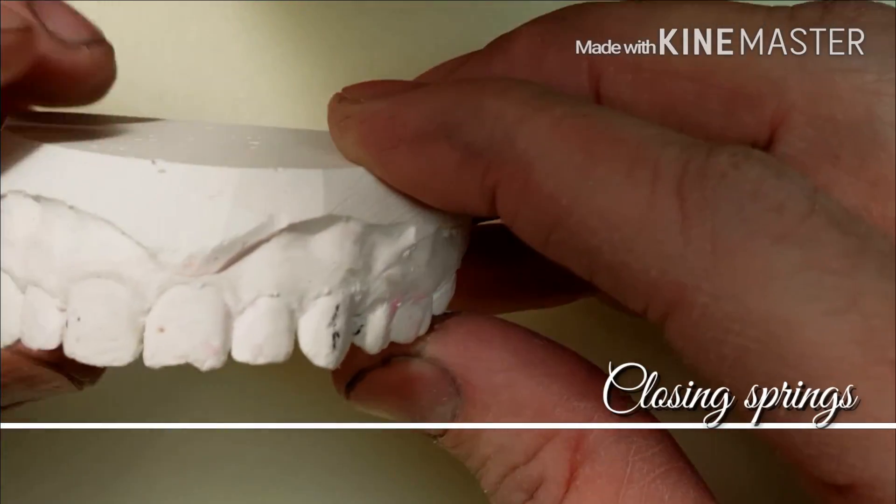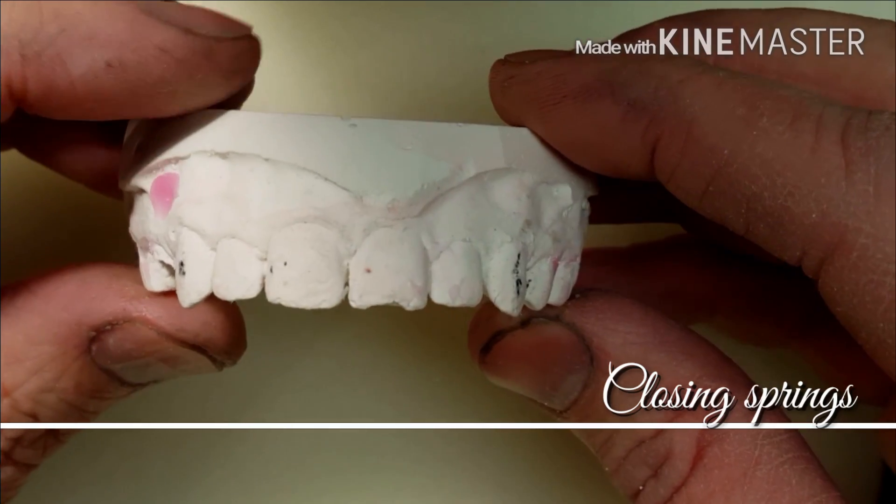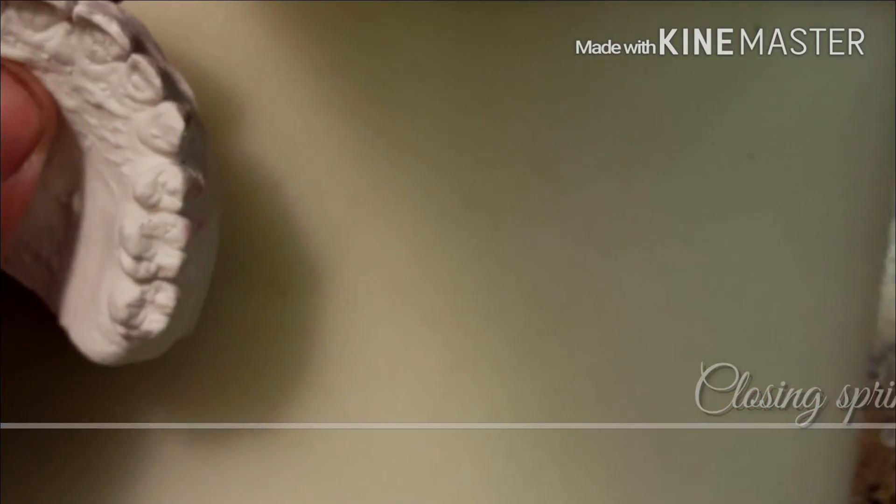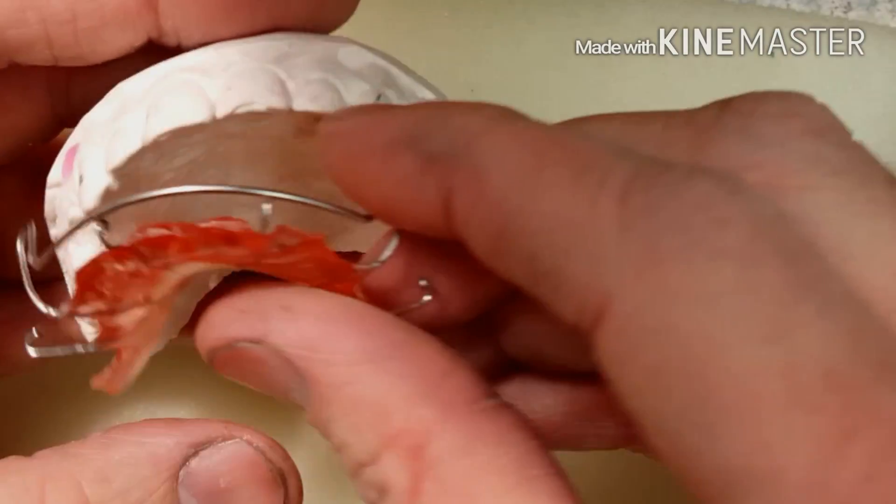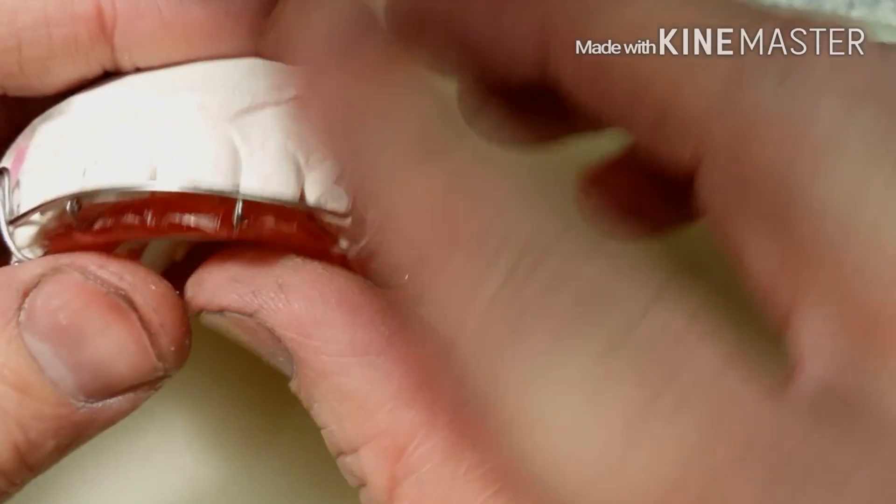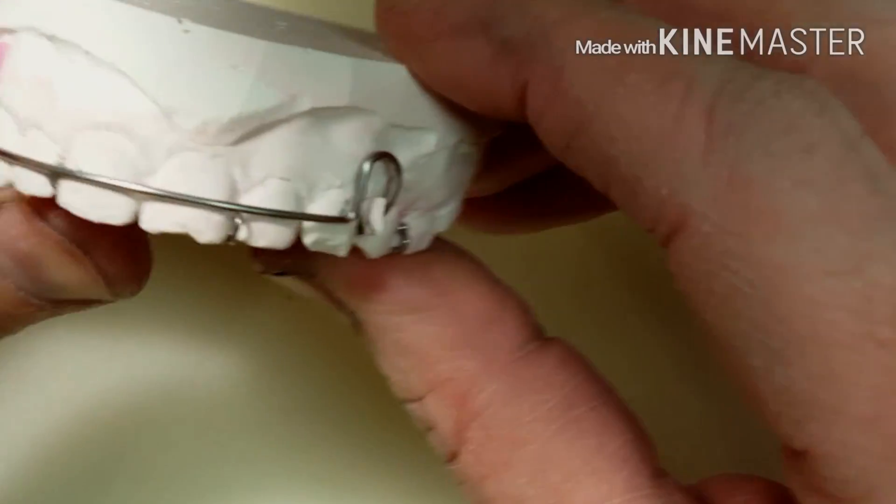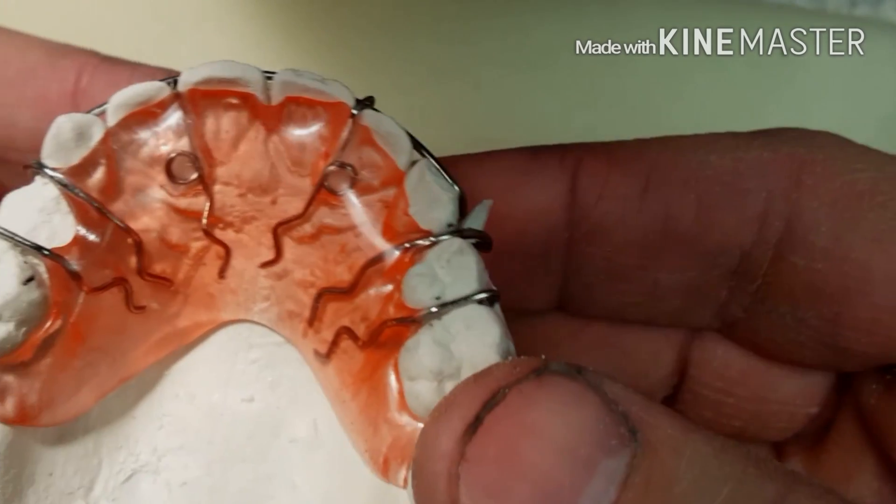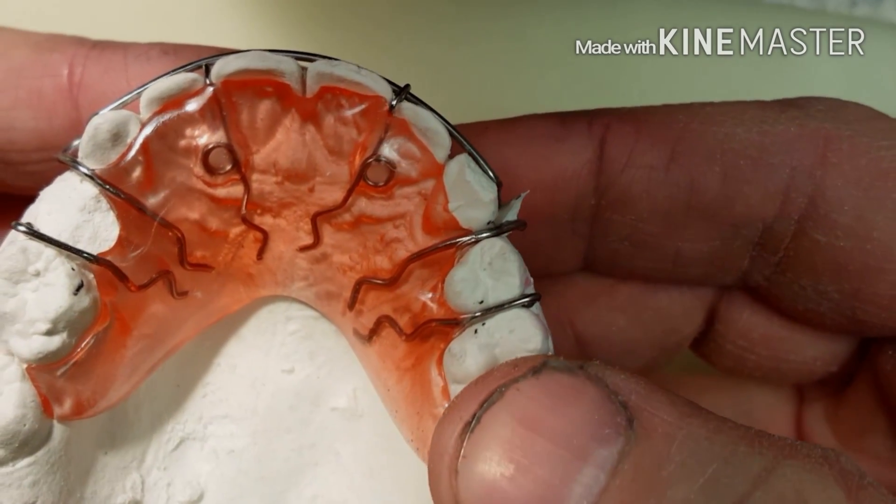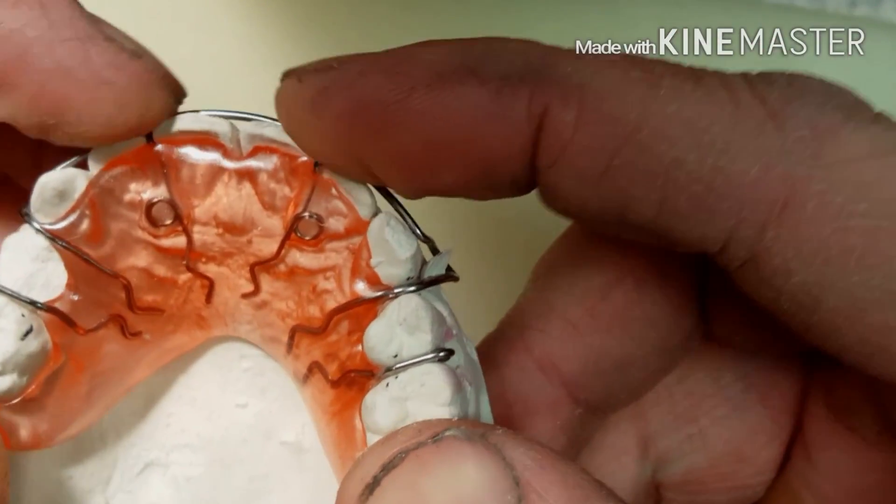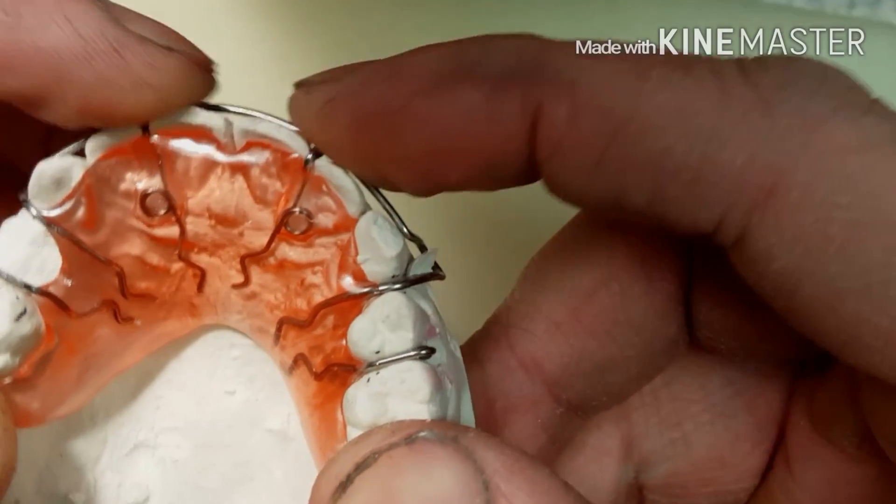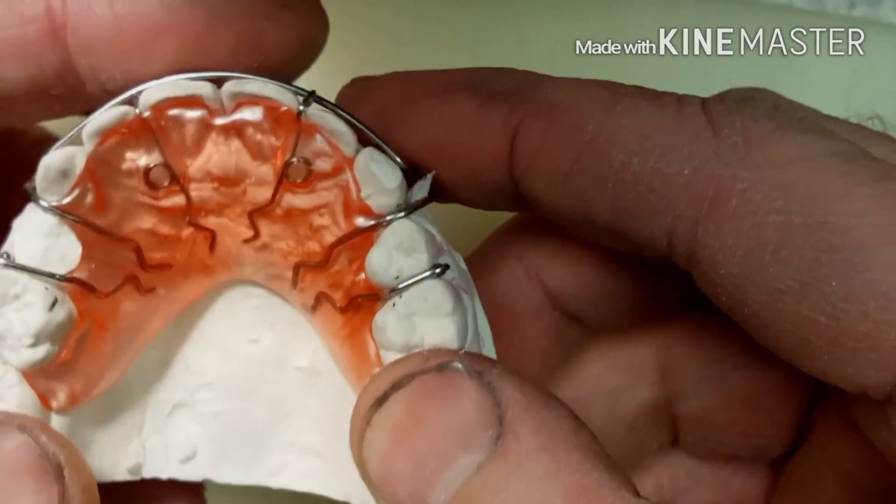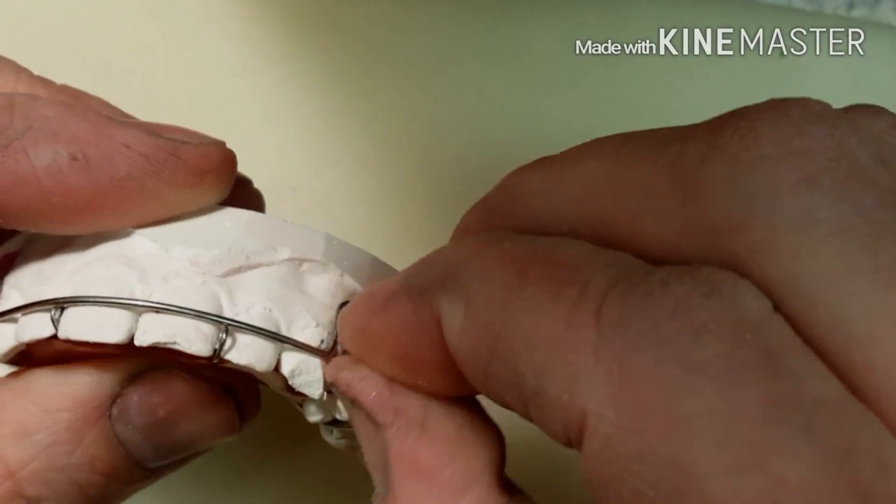Hi, this is a quick video on how to close a diastema using finger springs. In this video, I'm going to show you a quick demonstration. This is the finished product and what finger springs look like on a model, what they look like in the patient's mouth, and what they look like through the acrylic. Notice they're buried under the acrylic. Both springs easily move pressure towards the center of the midline to close up a diastema.